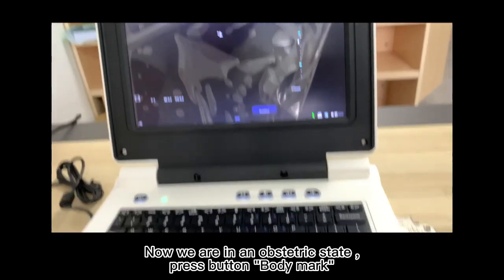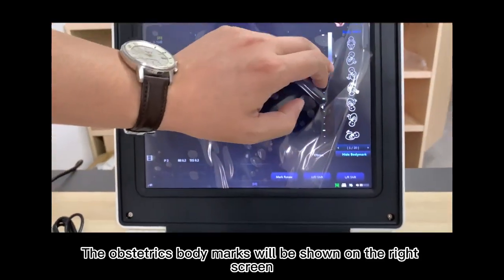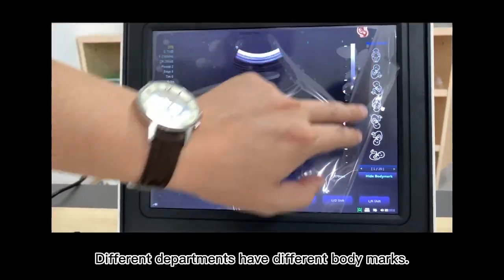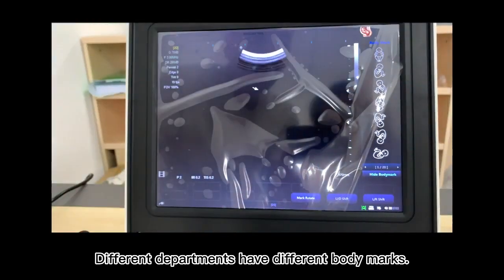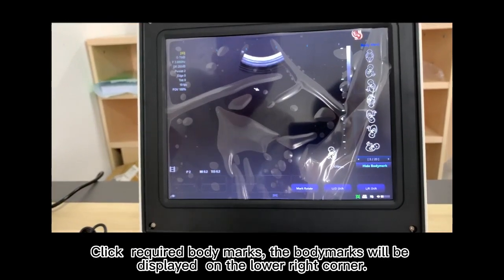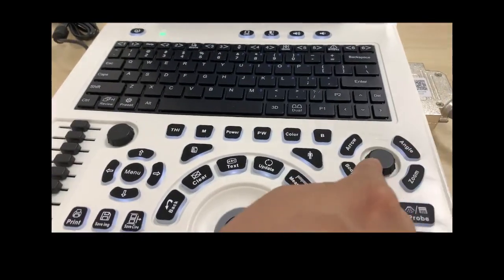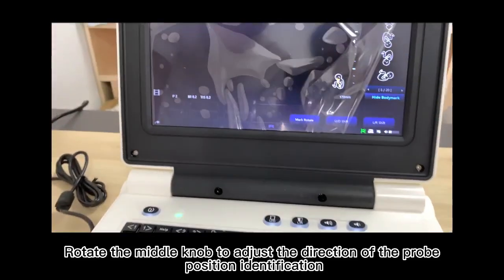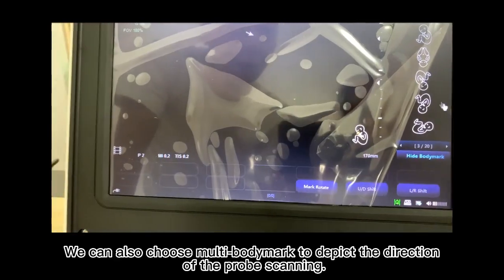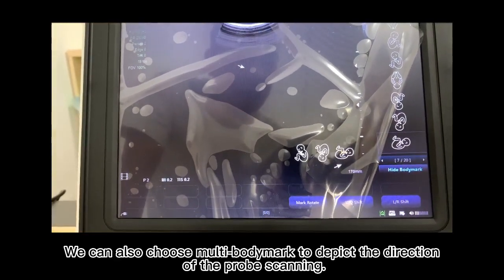Now we are in an obstetric state. Press the button body mark. The obstetric body marks will be shown on the right screen. Different departments have different body marks. Click the required body mark, and it will be displayed in the lower right corner. Rotate the middle knob to adjust the direction of the probe position identification. We can also choose multi-body mark to depict the direction of the probe scanning.